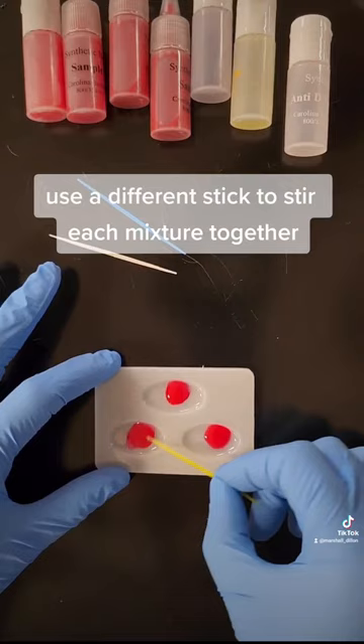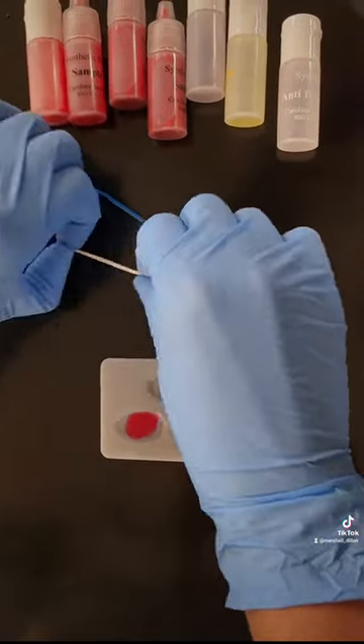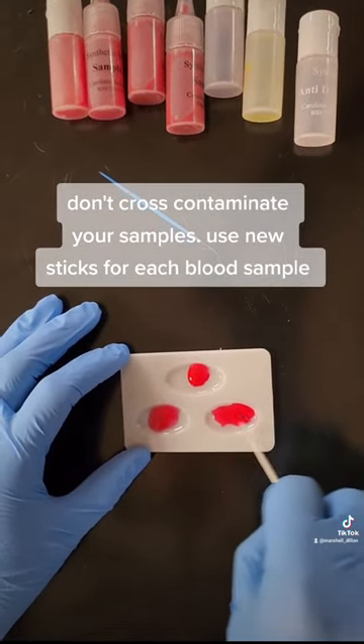Use a different stick to stir each mixture together. Don't cross-contaminate your samples. Use new sticks for each blood sample.